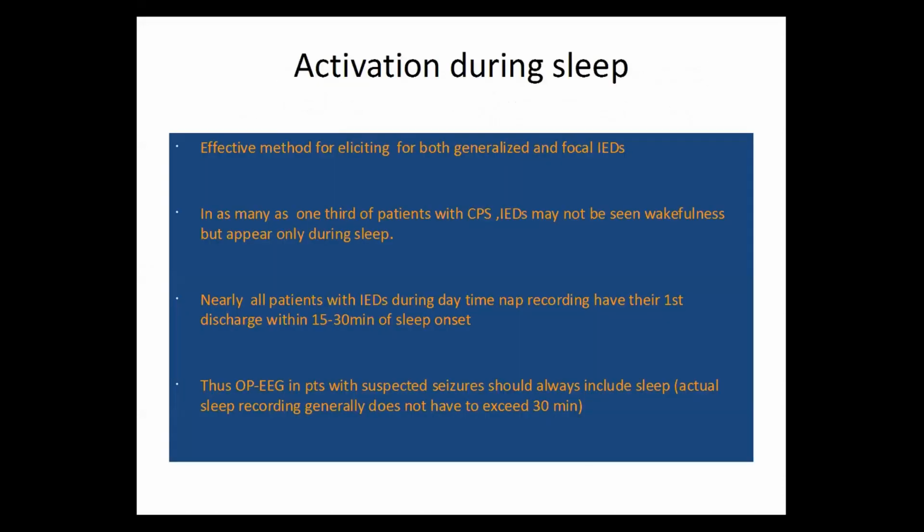Now, having discussed hyperventilation and photic stimulation, the activation during sleep is a very, very important procedure. Both generalized and focal IEDs can be activated, but we should understand that in generalized epilepsy syndromes, idiopathic generalized epilepsies, they are predominantly activated during the awake state. But the focal epilepsies are the ones which are predominantly activated during sleep.